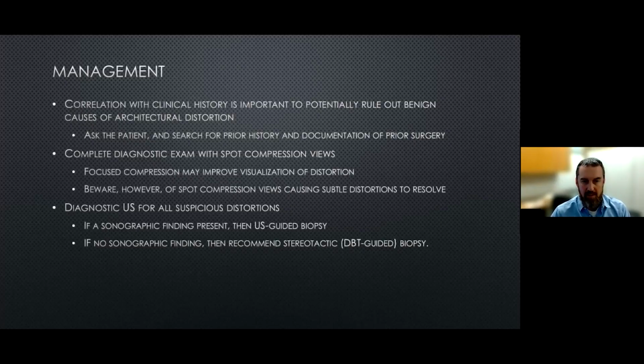If a sonographic finding is present, then of course ultrasound guided biopsy is the way to go. If there is no sonographic finding and you're still worried about the distortion based on the mammographic views, then of course stereotactic biopsy is recommended. And we have the benefit of having DBT or tomosynthesis guided stereotactic biopsies to make that sort of biopsy even easier to do.